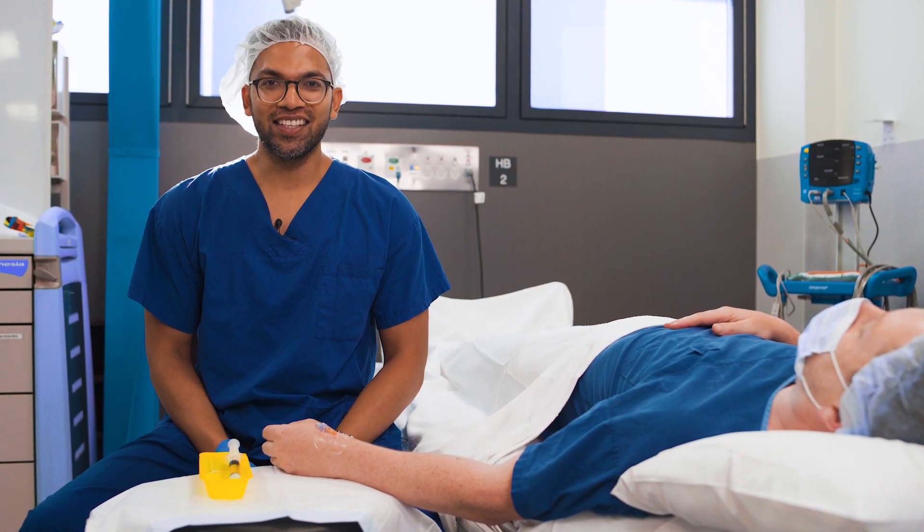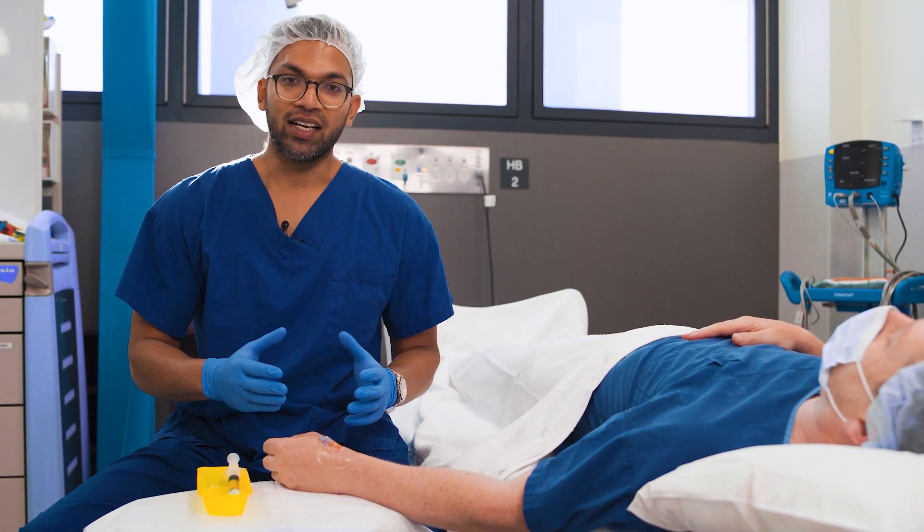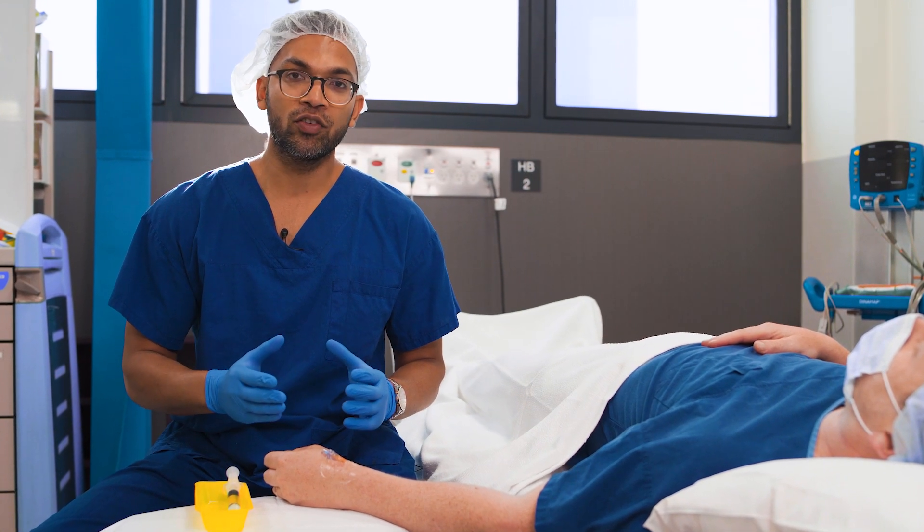Hi everyone and welcome to ABCs of Anesthesia. One of the things that I've been asked many times over is how do you know if you're actually in the vein? There are a few things to make me certain, absolutely certain, and I try to follow all of these things at different times.